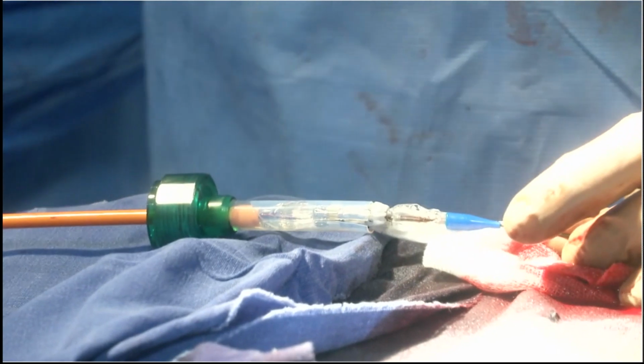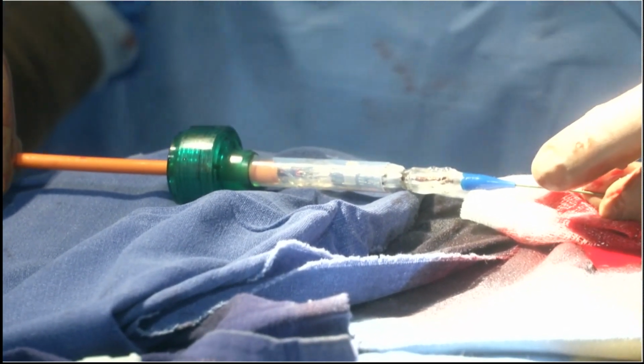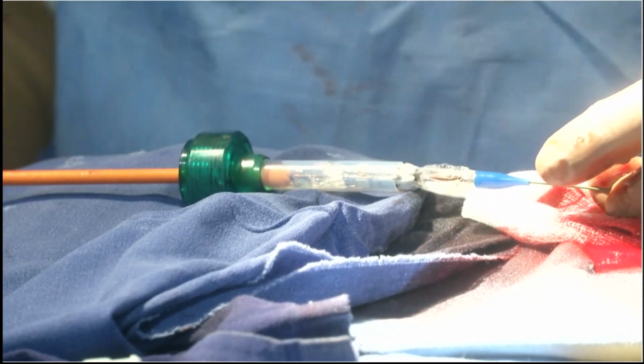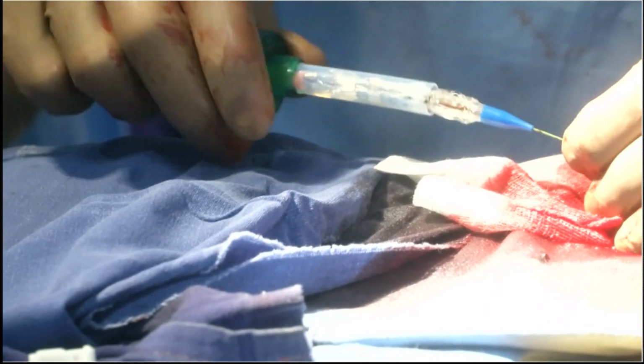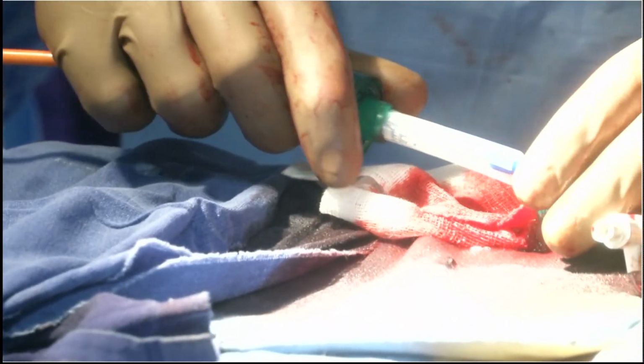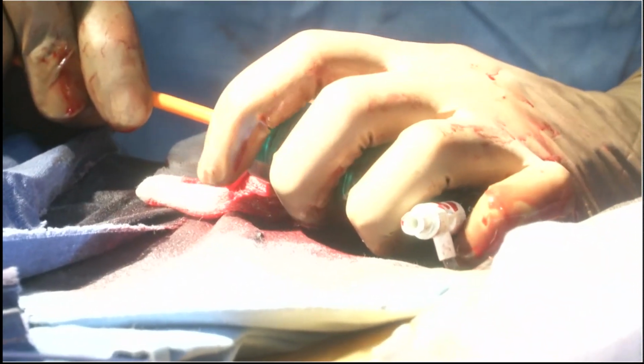So it's already been loaded to the wire. First you push the loader inside, then the valve comes out. Just give forward traction. Okay, Sengo, please go ahead. We're going to push the loader. Can you show it now? So you're going to put the loader and the valve.